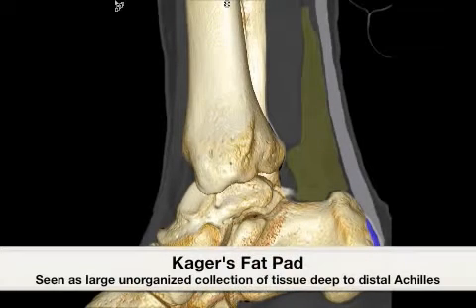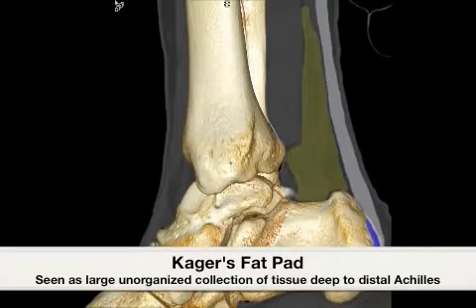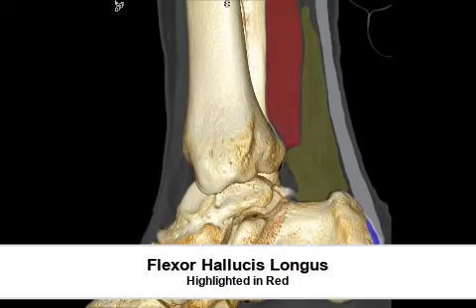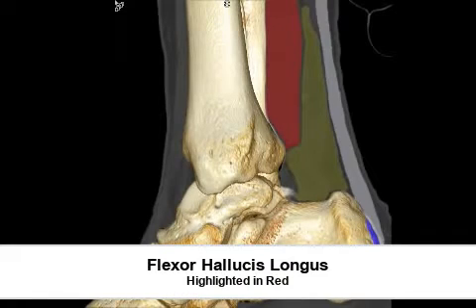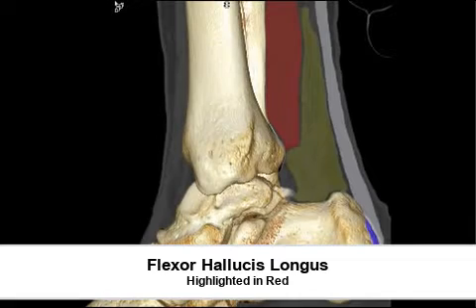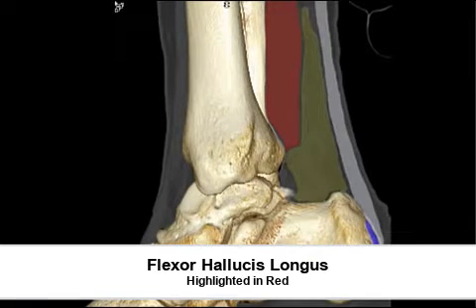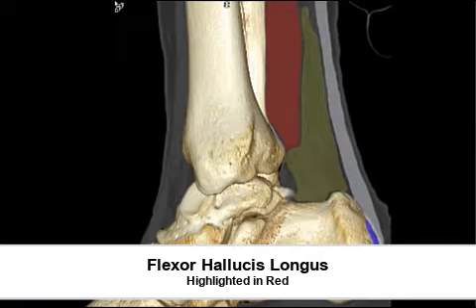Highlighted here in yellow represents Kager's fat pad as an unorganized collection of tissue deep to the Achilles tendon. The red indicates the flexor hallucis longus muscle, which is deep to the Achilles tendon and deep to the distal edge of the soleus muscle, which is not highlighted here.